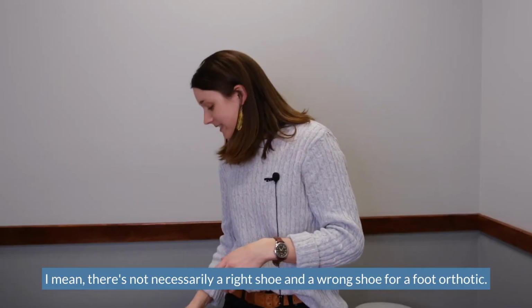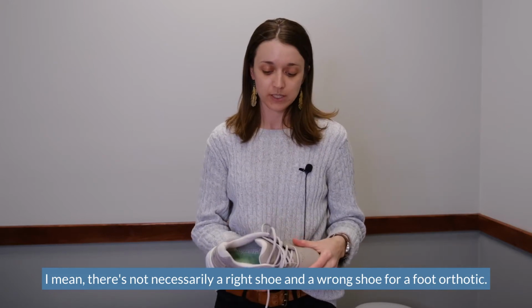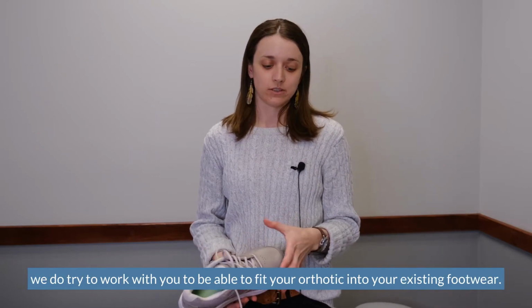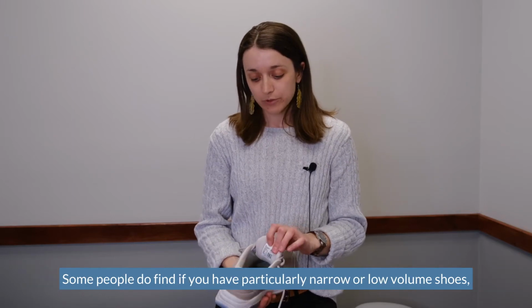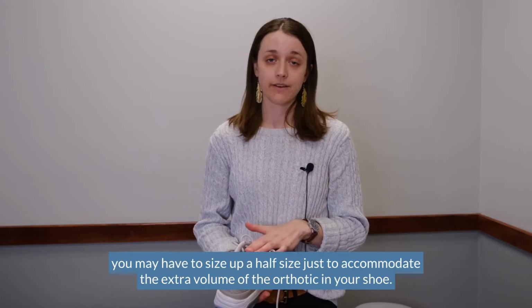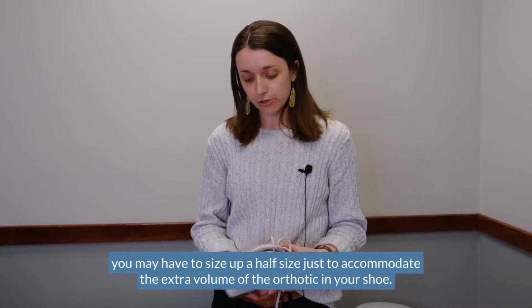There's not necessarily a right shoe and a wrong shoe for a foot orthotic, depending on what symptoms you have and what your day-to-day life looks like. We do try to work with you to be able to fit your orthotic into your existing footwear. Some people do find if you have particularly narrow or low volume shoes, you may have to size up a half size just to accommodate the extra volume of the orthotic in your shoe.